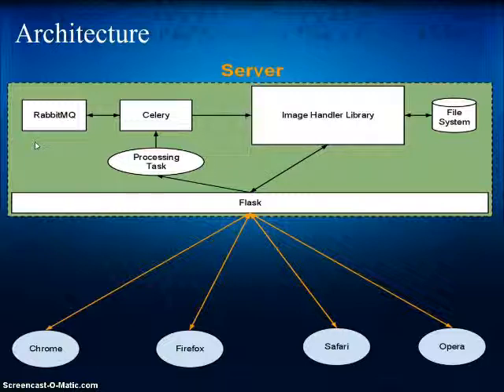And we're using a crude version of a NoSQL database in that we store a kind of JSON file on disk that contains properties and locations of files and file names for accessing, as well as saving some configuration and user-defined data that we'll get into a little more later.